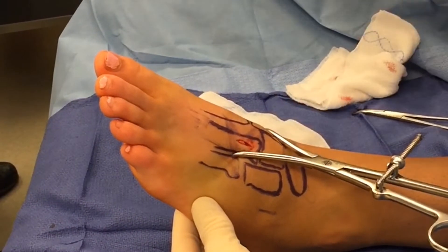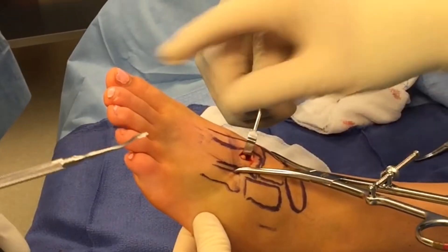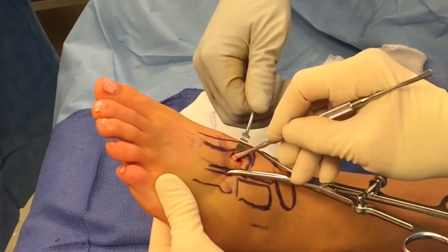Blunt dissection is continued down to the Lisfranc articulation. A freer elevator is then used to sweep out the Lisfranc articulation of any debris or invaginated ligamentous tissues. This can be done through a small percutaneous incision.